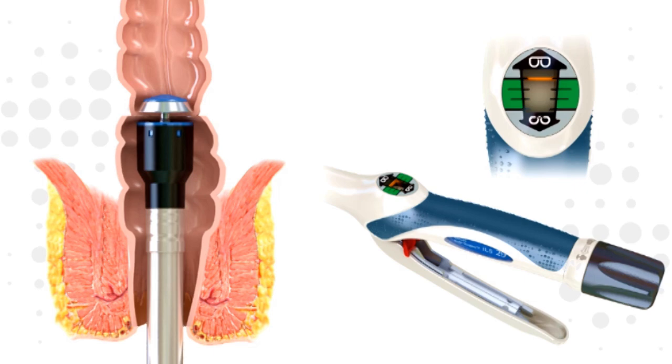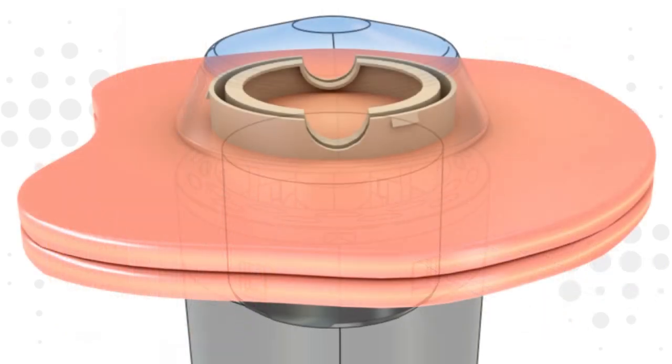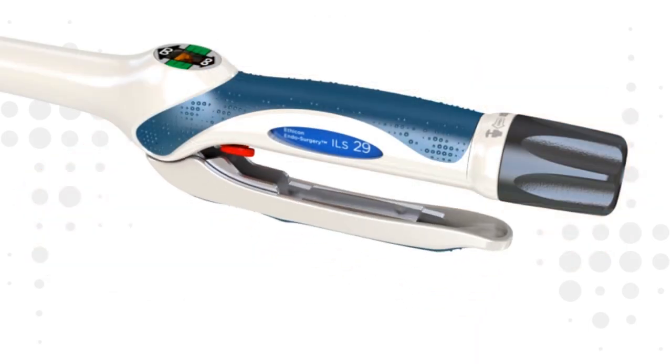Continue to adjust the device until the tissue is adequately compressed for a proper anastomosis. To fire the device, the red safety is removed and the firing trigger is squeezed with a firm, steady pressure. The device will provide audible and tactile feedback through the breakaway washer, indicating the firing sequence has been completed.